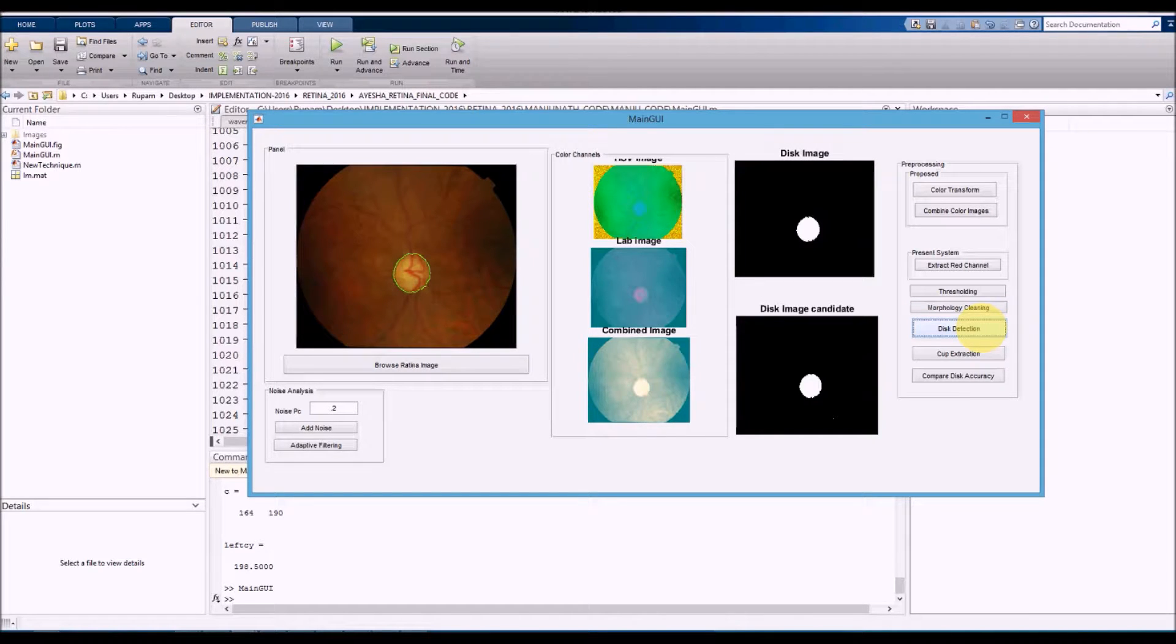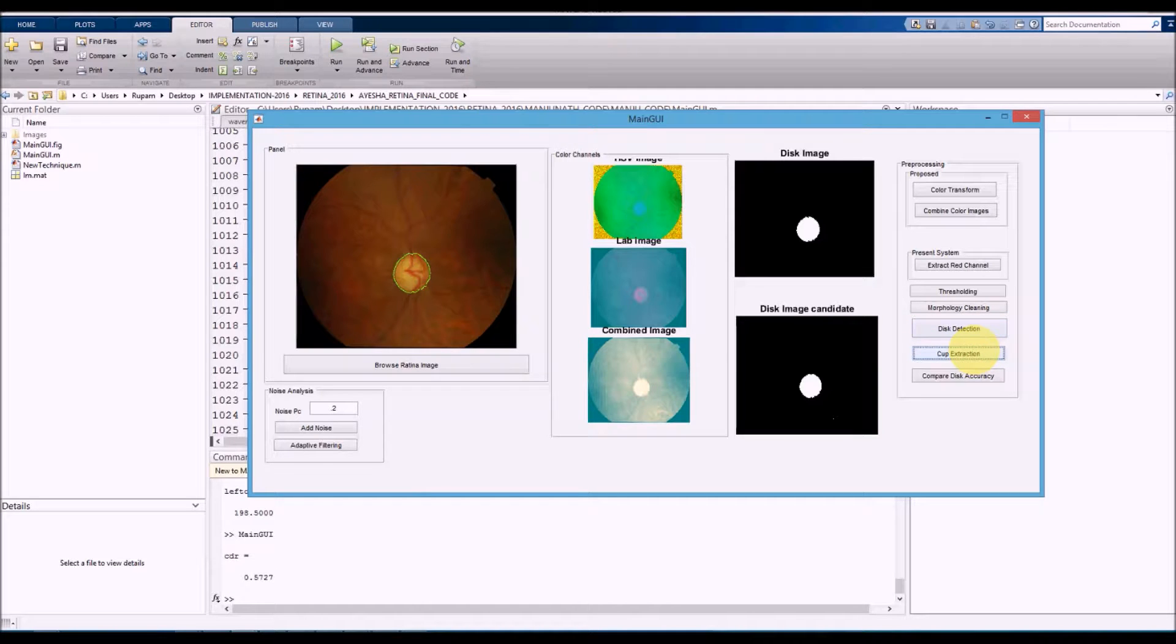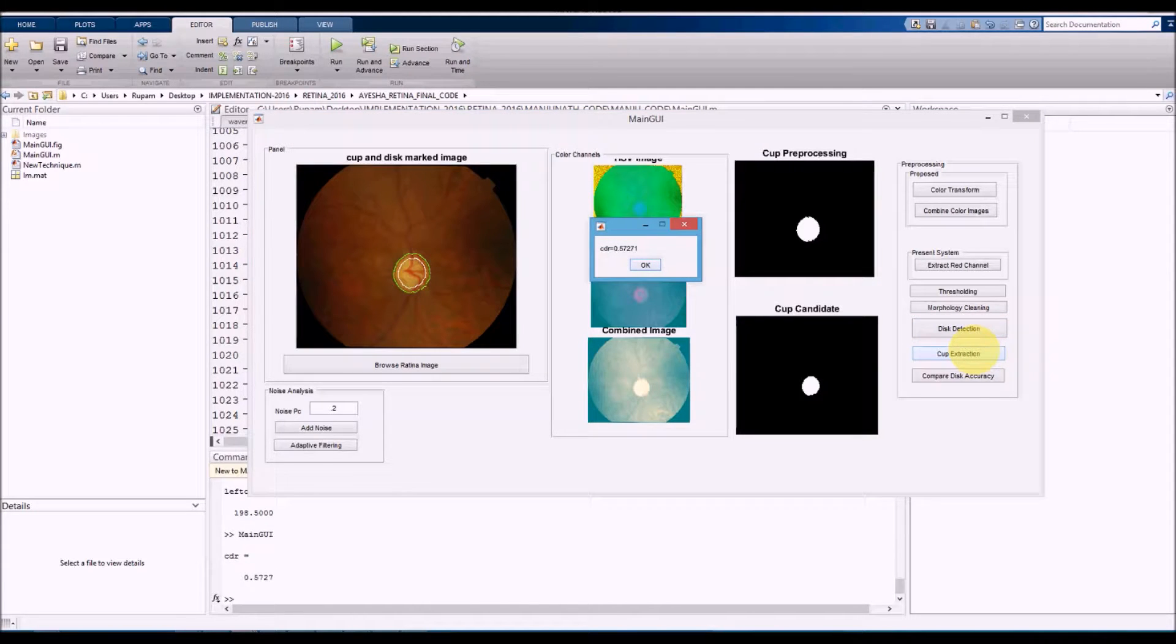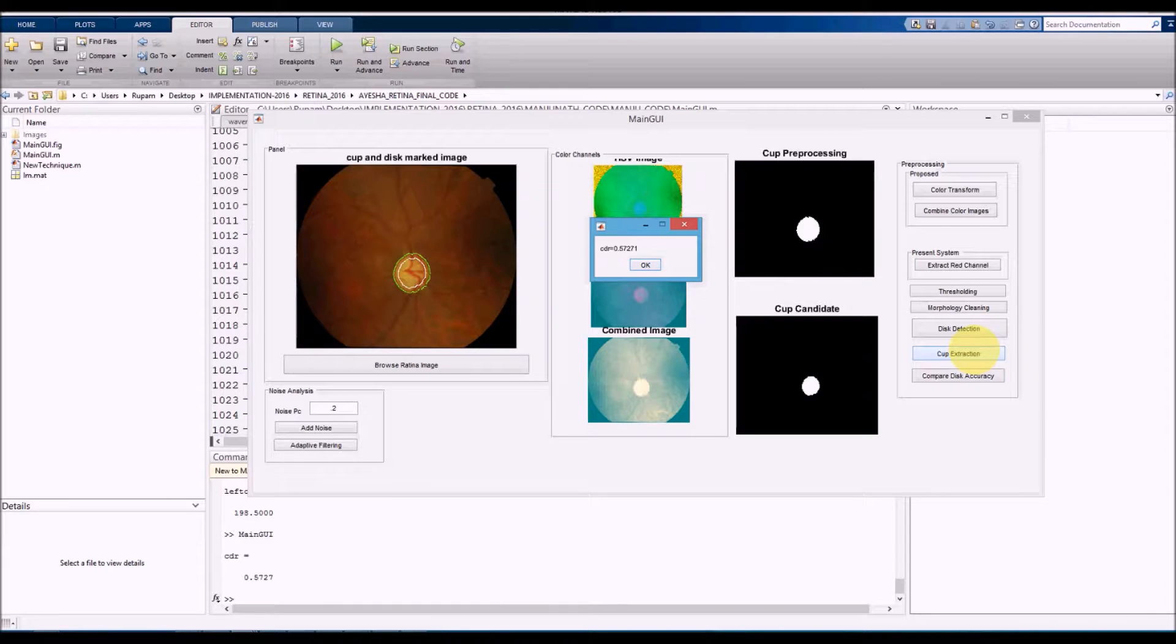When we detect the disk, you can clearly see that this disk boundary is being correctly traced. Once the disk is detected, we click on cup detection. Once you click on cup detection, the cup area is clearly marked, followed by the total ratio of the cup area divided by the disk area.